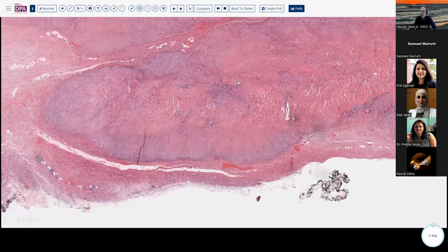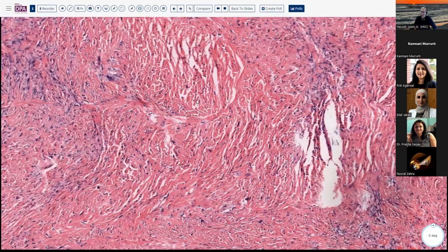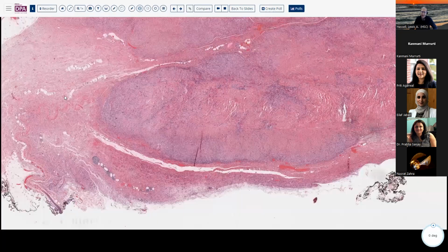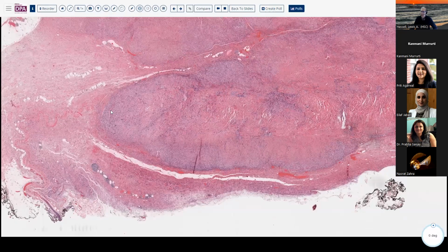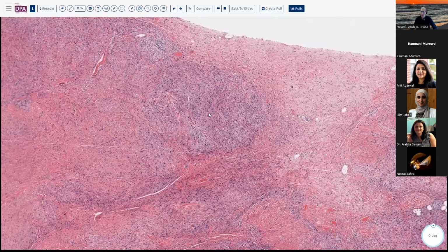This tumor also has a very high density of the fibrous, collagenous component. Some of this may be the pre-existing fascial fibrous tissue that's just been accentuated or added onto, but you can see the variable histology here.